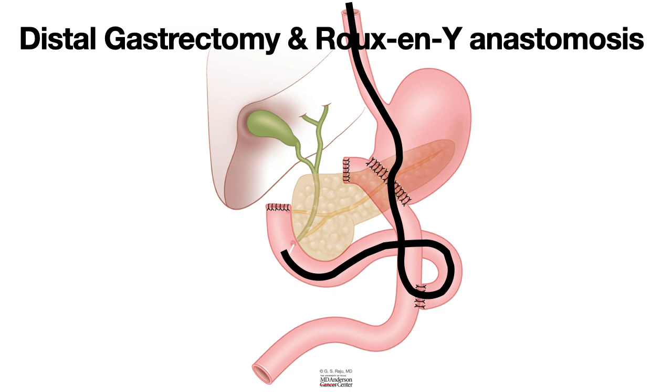And with cannulation and injection, you can create a cholangiogram. When you see somebody with a long afferent limb, and you are not able to reach that site, options include asking an interventional radiologist to do a cholangiogram by the percutaneous route.